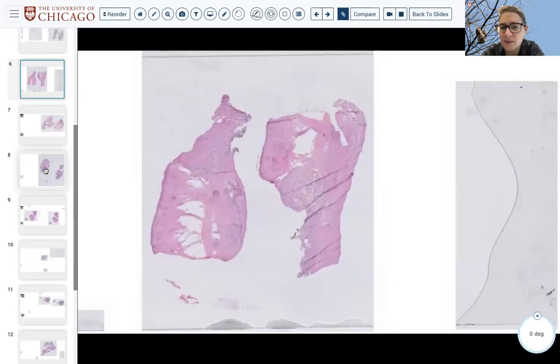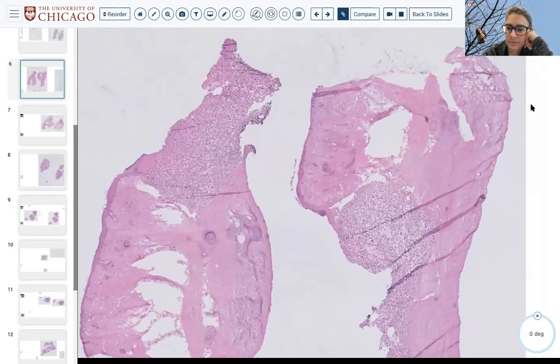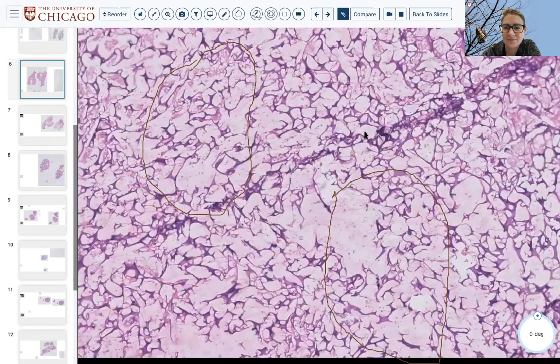I think you guys got this one, which was skin. So did anybody see anything in the skin? And can you guess what the patient's history might have been? I mean, there's this whole area, let's see if I can draw, right here. That's a little unusual. And then here, it kind of looks like it was embolized at one point. Was it possibly tumor that then kind of liquefied?